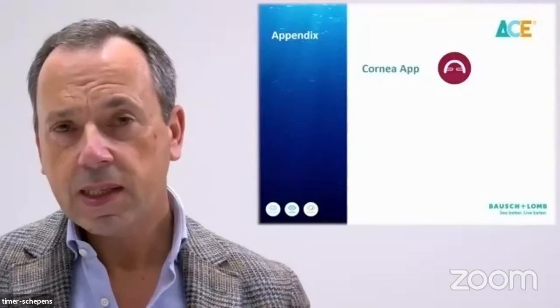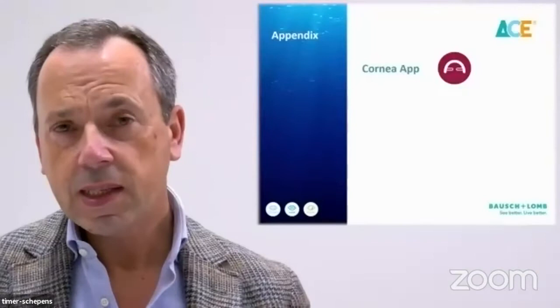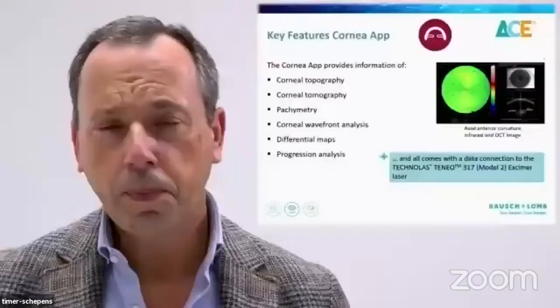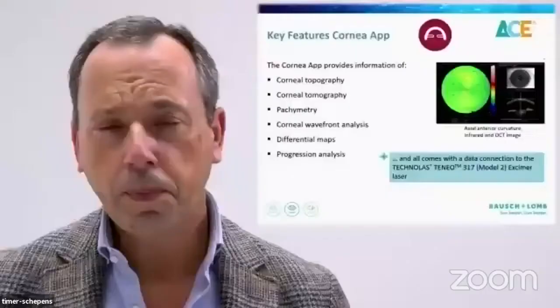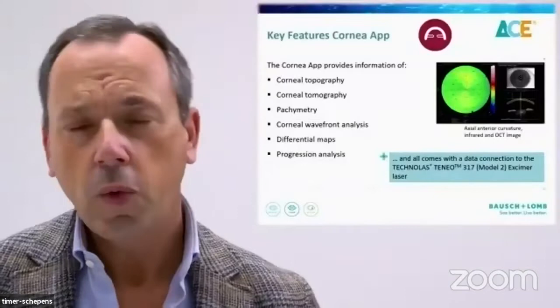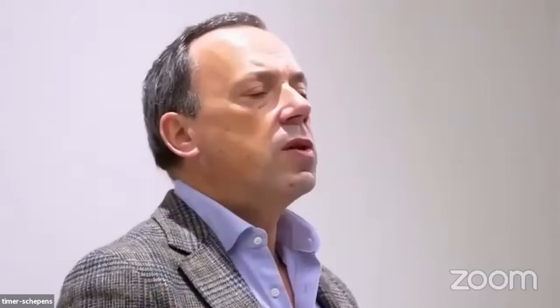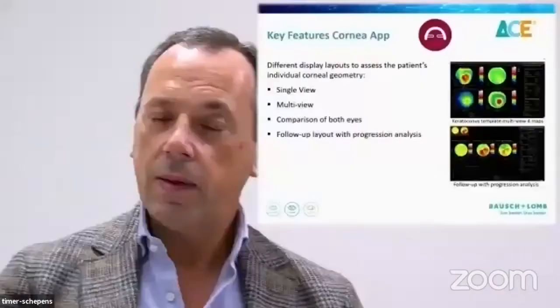We're going to talk today of the corneal app. As you know, ACE has several apps, but the one that is more important to me as a refractive surgeon is the corneal app. In the corneal app, we have topography, we have tomography, we have pachymetry, we have wavefront analysis, differential maps, and in case of keratoconus disease, we have a progression analysis also. We have the option of several displays. The ones that we use the most are the single view, the multi-view, comparison of both eyes, and the follow-up layout.